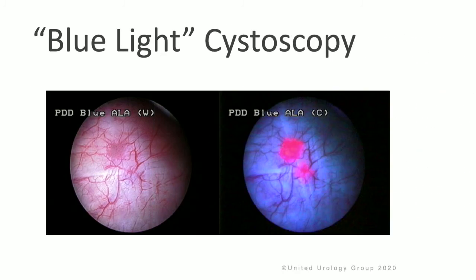You can see here when the blue light is activated, the area of concern lights up pink. This aids in the doctor's ability to resect the tissue and diagnose bladder cancer.